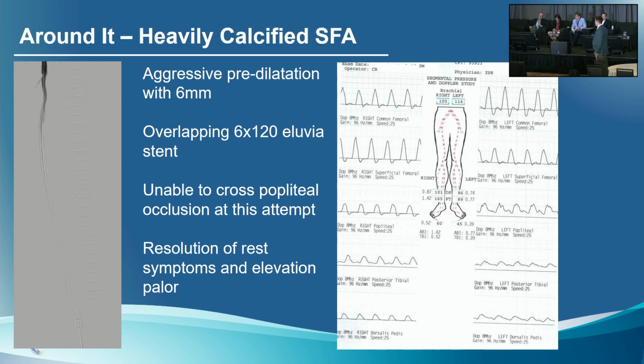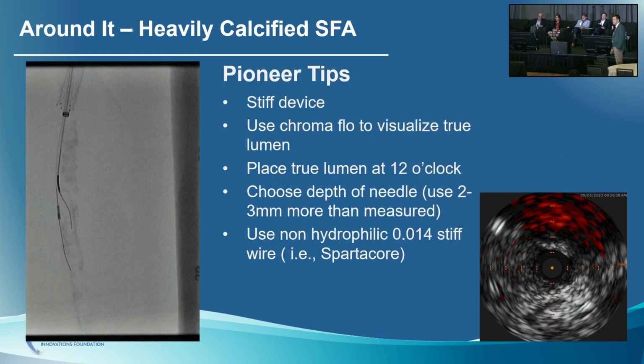If you were to do IVL, you would lose partly or completely the benefit in the subintimal space. This is just a thought we can discuss. When you create a long, substantial subintimal tract, the purpose of a scaffold at that point is not ideally to hold that space open. There would be good logic to put in a regular balloon, expand it, and see in two projections, but I wasn't sure IVL per se would be anything beneficial, unless you're paid by the government.